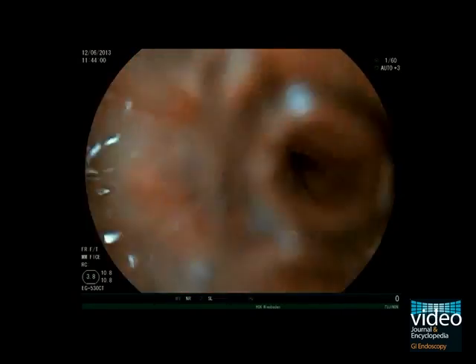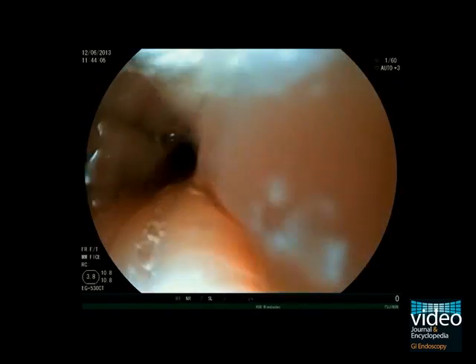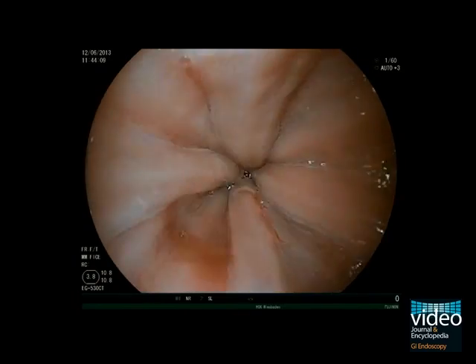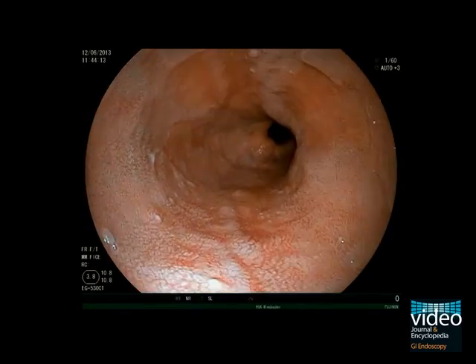In case of mucosa irregularities, targeted biopsy samples should be performed. If no irregularities are identified, four-quadrant biopsies according to the Seattle Protocol are recommended every 1-2 cm along the Barrett segment.